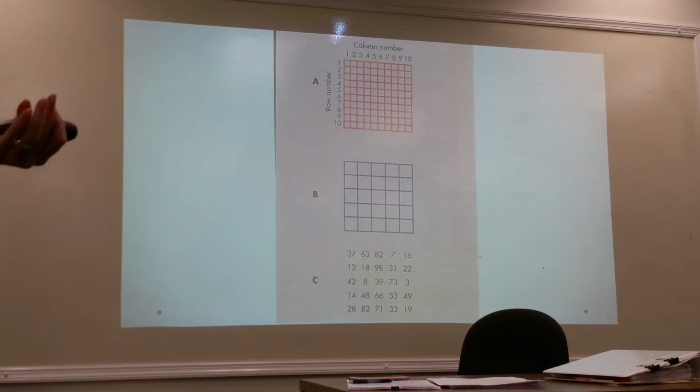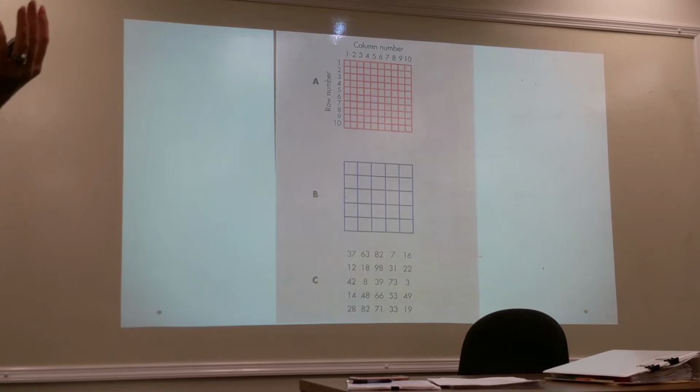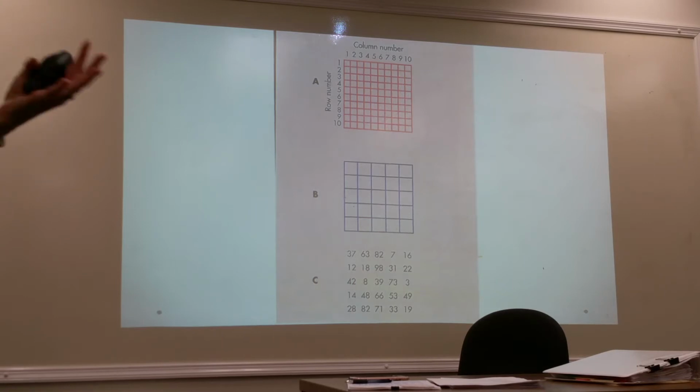So when you do a chest x-ray on a male, as an example, you're not doing chest x-rays. Lower leg. Okay, well, a lower leg as an example, but a lot of times we turn the cassette sideways. Like for a male chest x-ray, we turn it sideways. On females, I tend to put it lengthwise. I think your book says to put it crosswise for everybody. Well, that's 17 inches crosswise. Well, we've lost an inch with this detector.